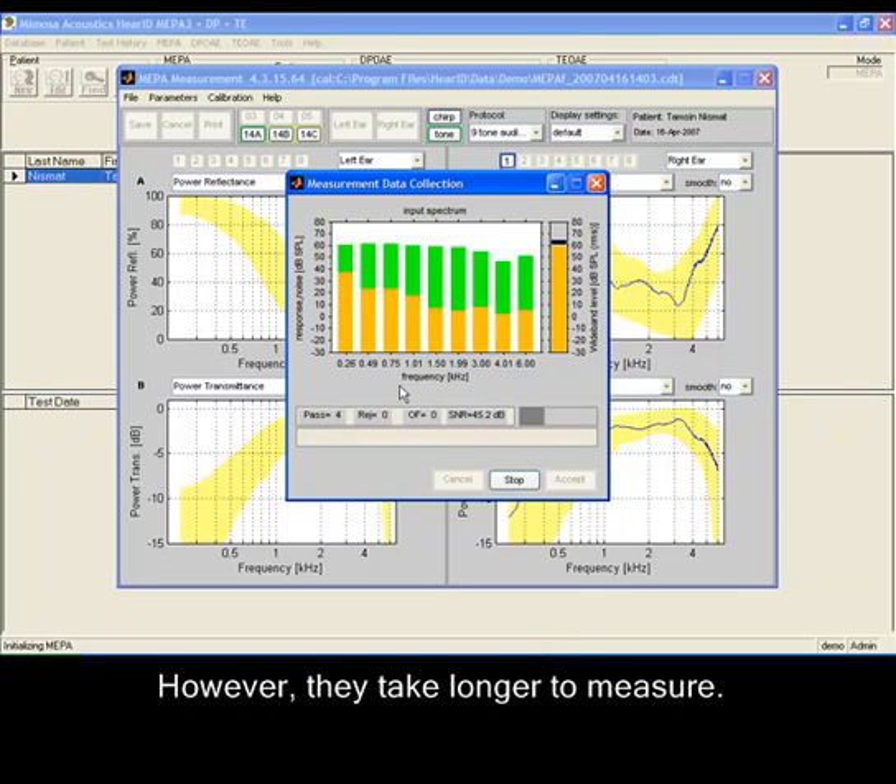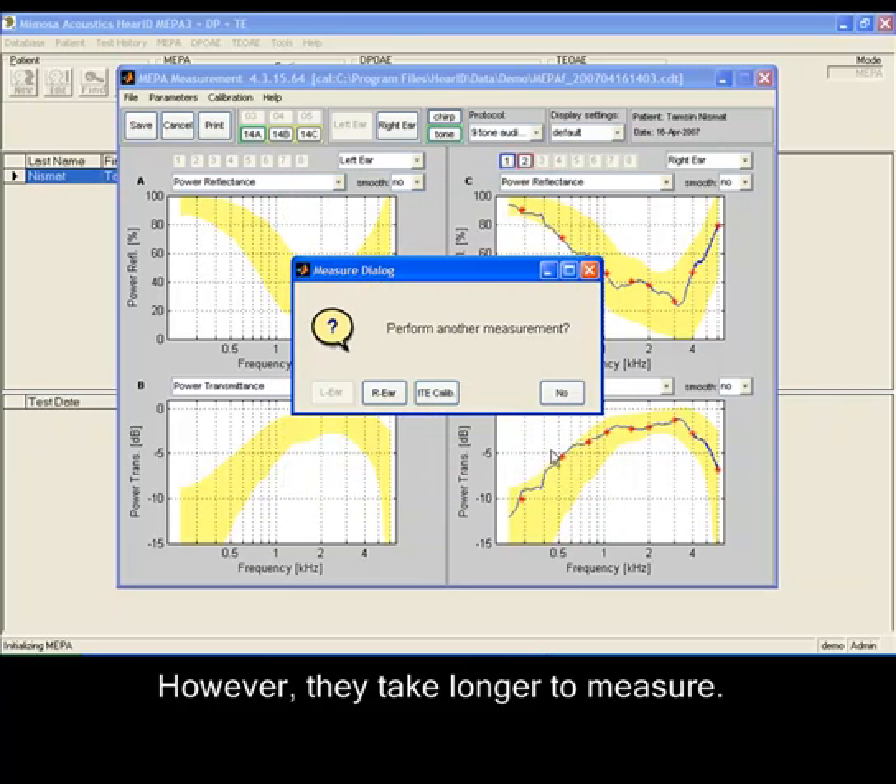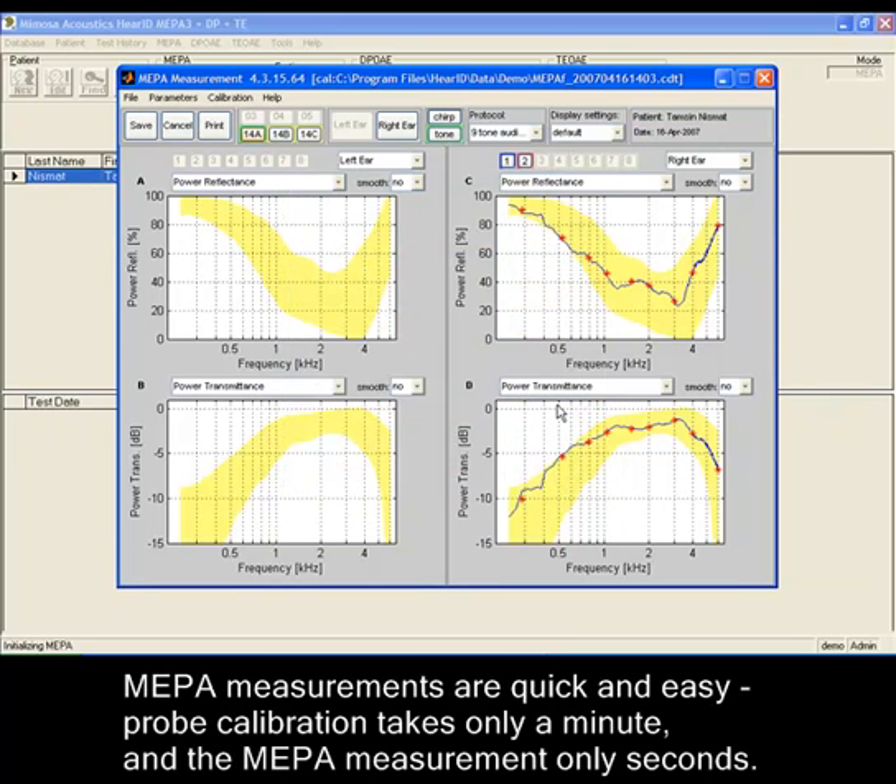However, they take longer to measure. MEPA measurements are quick and easy — probe calibration takes only a minute and the MEPA measurement only seconds.